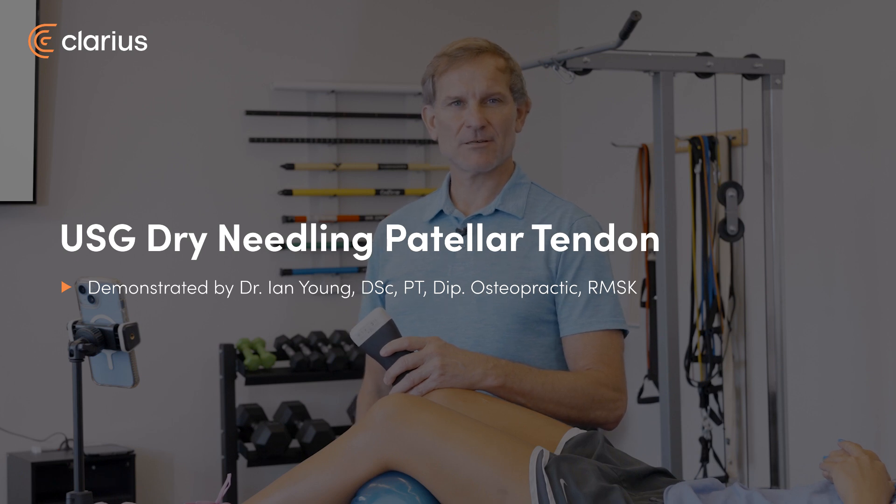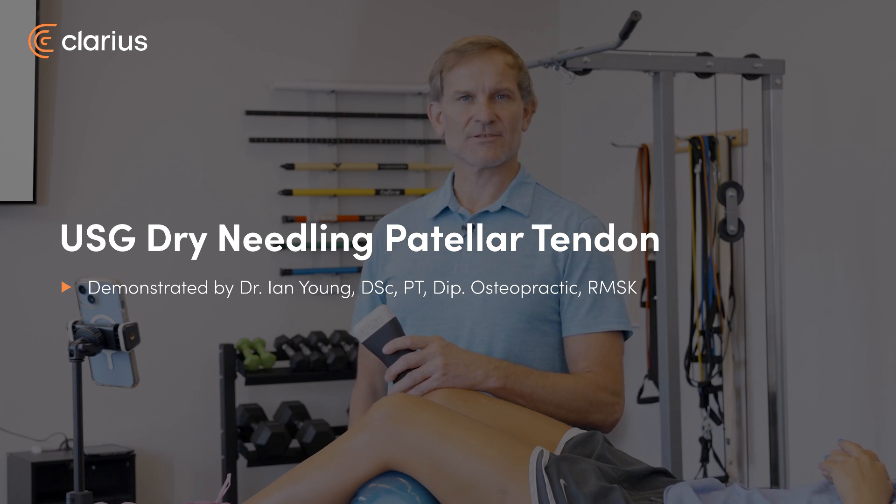Welcome, I'm Dr. Ian Young with Tybee Wellness out of Savannah, Georgia and the American Academy of Manipulative Therapy's Fellowship in Ultrasonography. Today I'm here to demonstrate an ultrasound guided dry needling technique to the patella tendon.